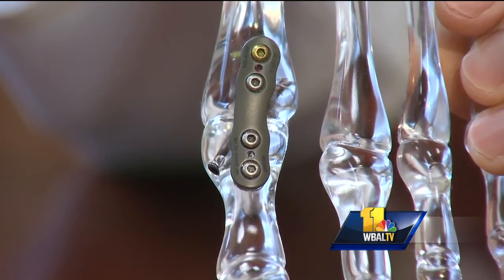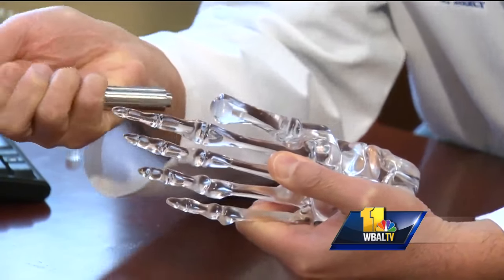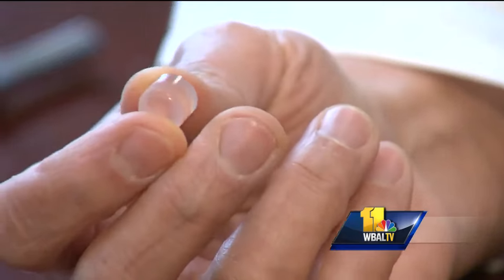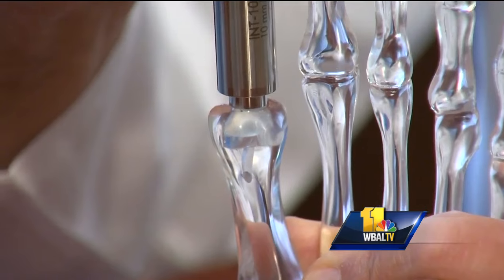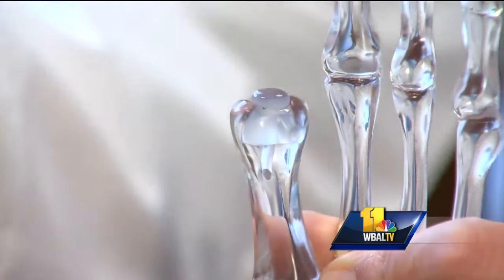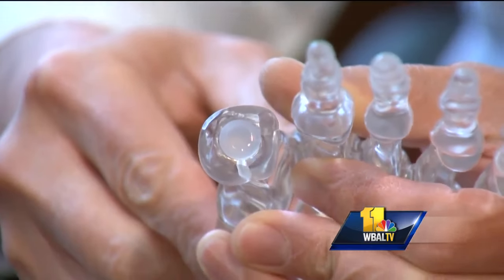Fusion took away the pain but patients lost range of motion. 'This is Cartiva. It's made out of the same material as contact lenses, but this material — called polyvinyl alcohol — has the same mechanical properties as human cartilage. We just push it in, and it keeps the arthritic surfaces apart so they don't rub and grind and cause pain, but it allows you to keep your motion.'